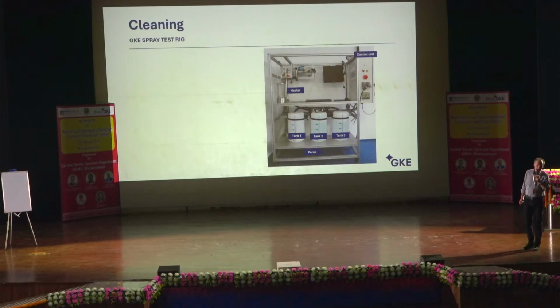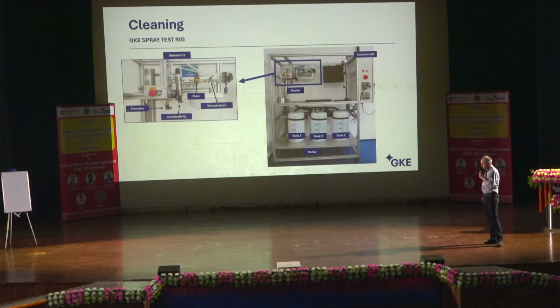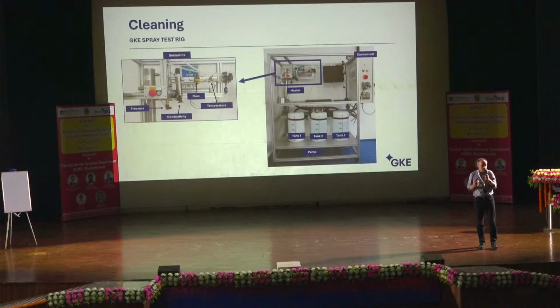We have carried out testing in our laboratory about cleaning processes, because we have found out that testing in a real washer disinfector makes no sense. It makes no sense because a real washer disinfector does not only wash, but it also dries, it also disinfects, and it does not have homogeneous conditions.